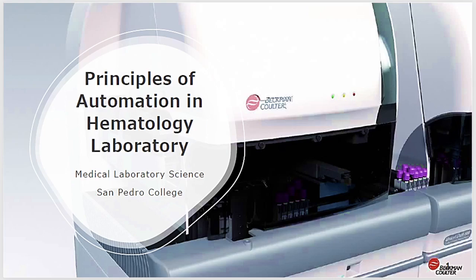Your automated blood cell analysis has virtually replaced your manual hemoglobin, hematocrit, and cell counting because of its greater accuracy and precision. We could release the result as soon as possible, and you can perform many tests in one run or in one series of testing.